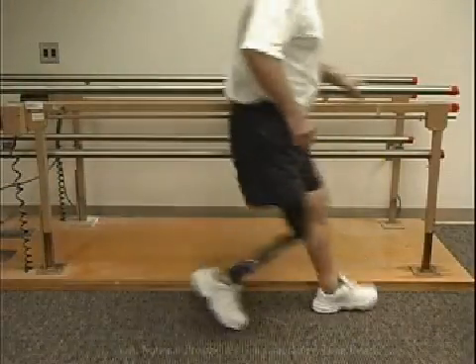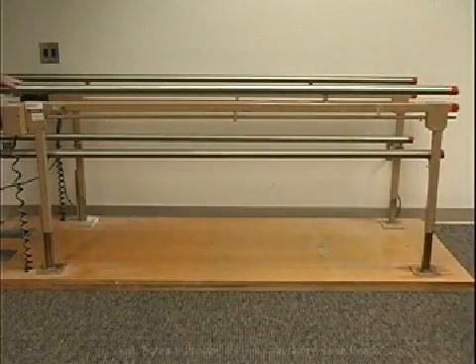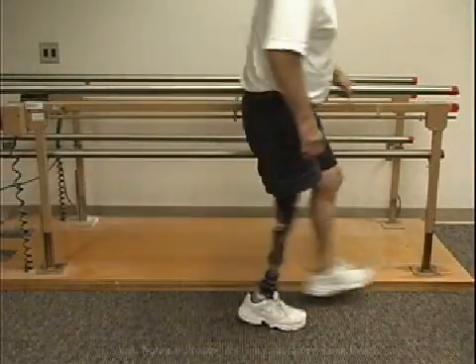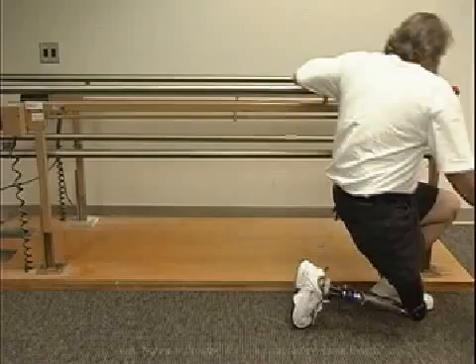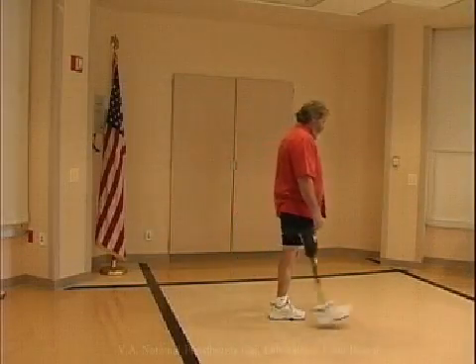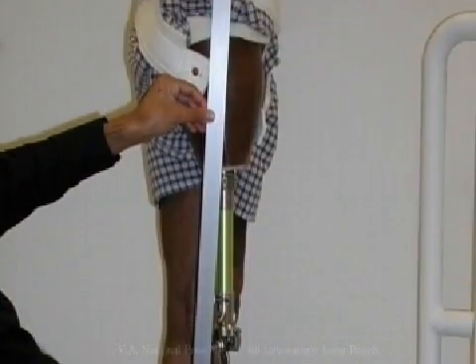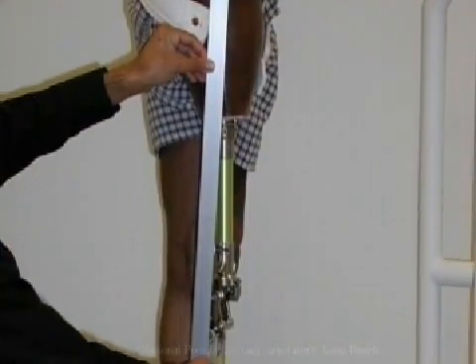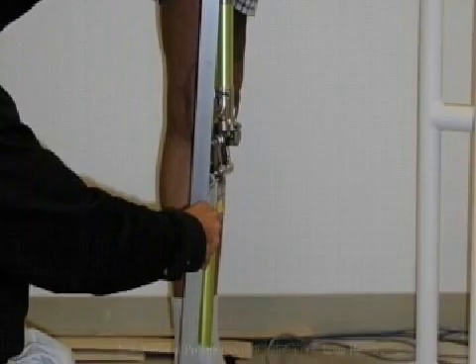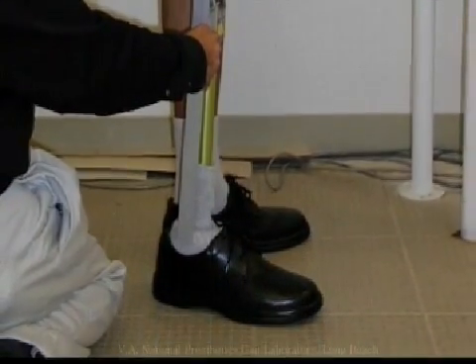Knee instability is an unacceptable gait deviation which can render an otherwise excellent prosthesis unsafe and unusable. In this condition, the knee flexes uncontrollably at loading response. A visual reference line has been traditionally used to place the socket, knee, and ankle in an appropriate spatial relationship as viewed in the sagittal plane.